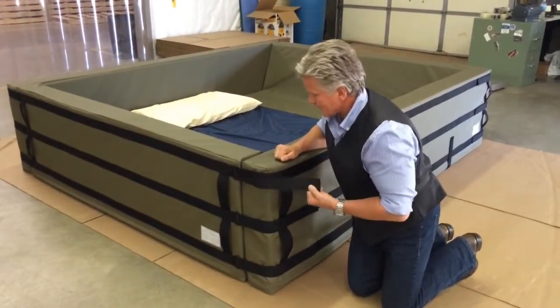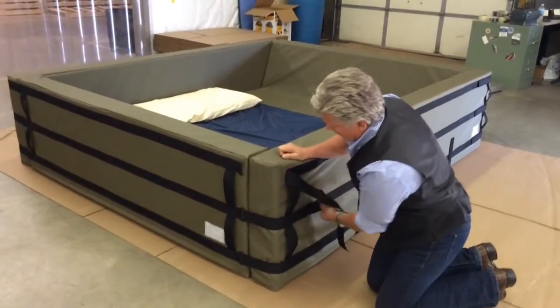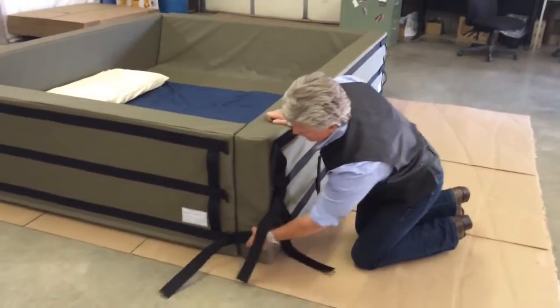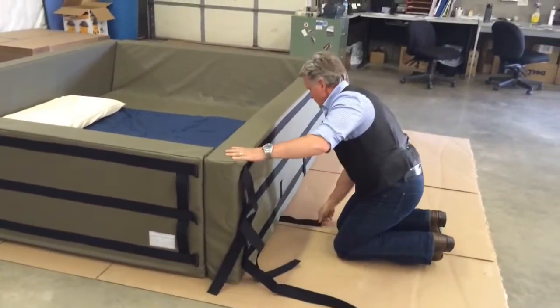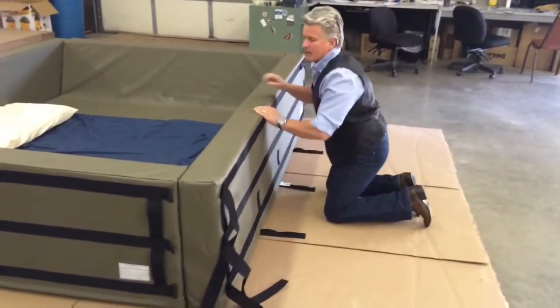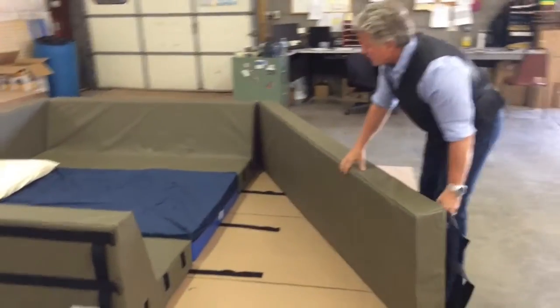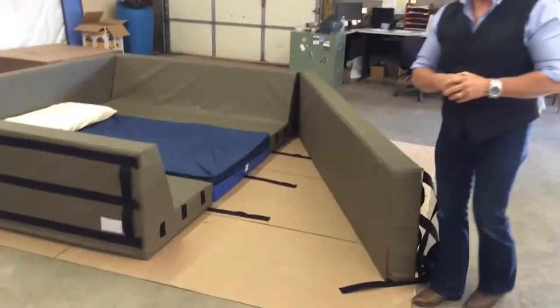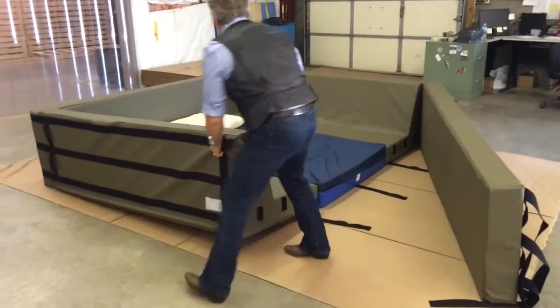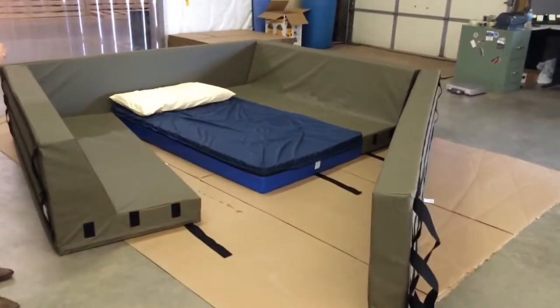So the system can be opened up. Popping the 3. We secure the footboard, and now we have access to open up and gain access to where the person would be resting. This side, again, can be opened up and brought out here if we need further access to it.